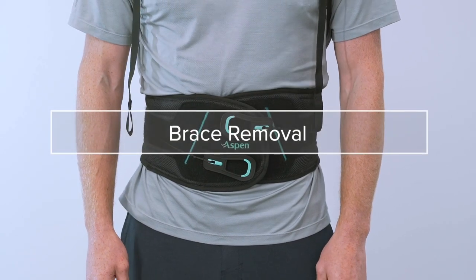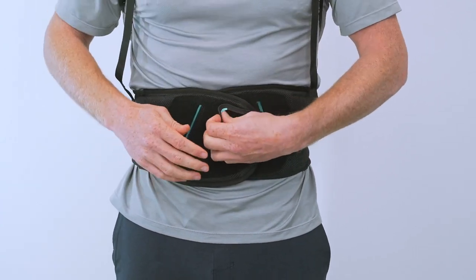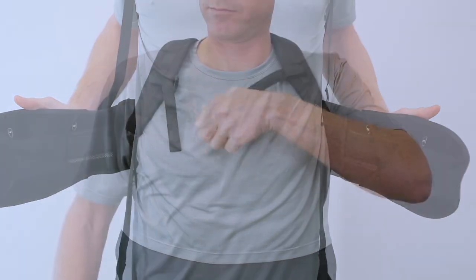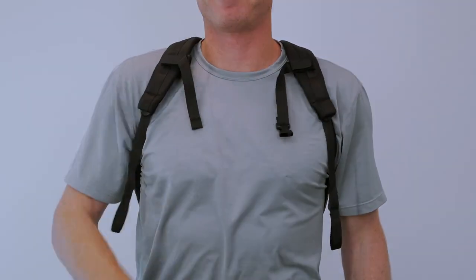Remove the brace by first removing the pull tabs and placing them towards the back. Then open the belt and pull out to fully extend the compression mechanism. For the Horizon Pro 456, lift on the shoulder straps to allow for additional slack for easy removal and application.